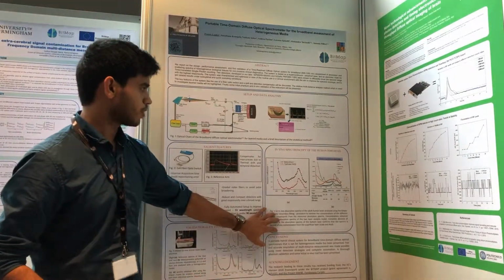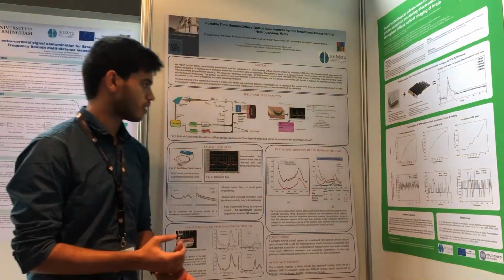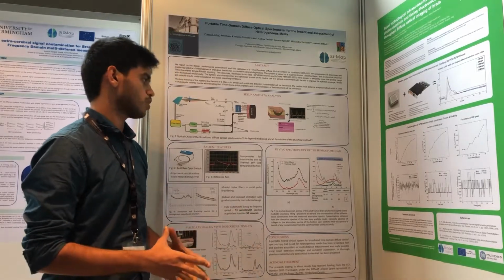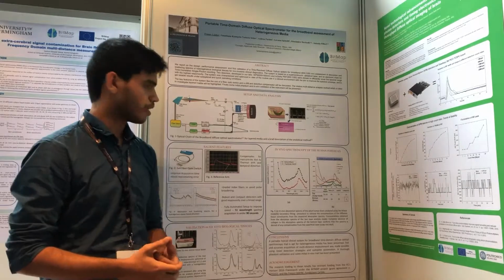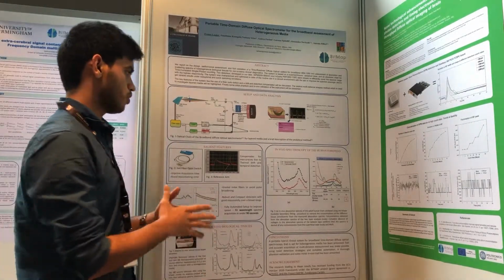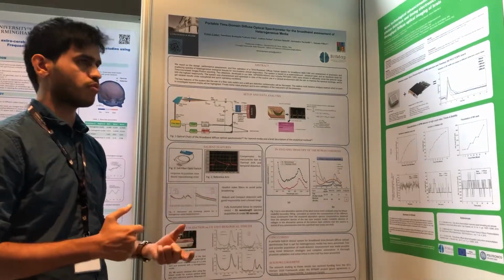With that, some initial in vivo measurement, acquisition and analysis as well for the two-layer model. Here you see we made a similar measurement on a healthy volunteer's head, and these were the retrieved absorption spectra. The top layer was assumed to be roughly 12 millimeter.